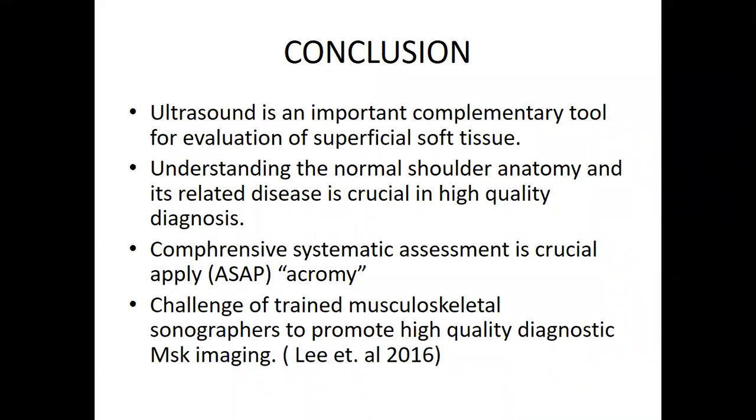However, I should also mention that ultrasound has better advantages compared to MRI when it comes to accessibility and low cost. You are able to compare the contralateral joint. You are able to give immediate feedback to the patient, communicate with the patient, and improve patient satisfaction. Unlike MRI, of course, with its superiority in terms of highly detailed information, but the patient will be there, you won't compare with this, and time consumption comes in.